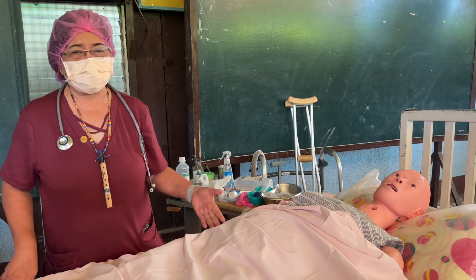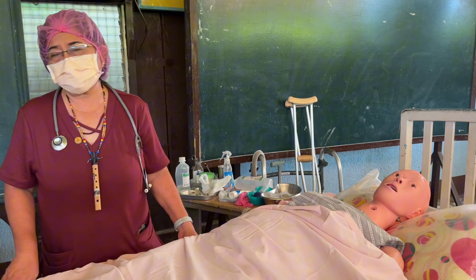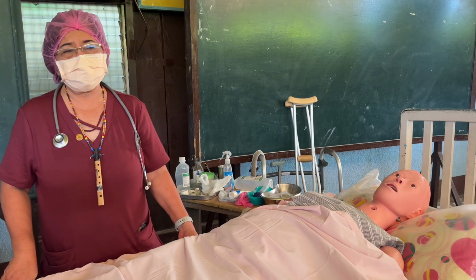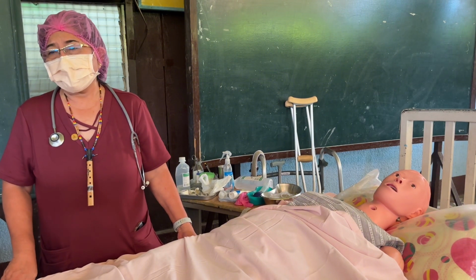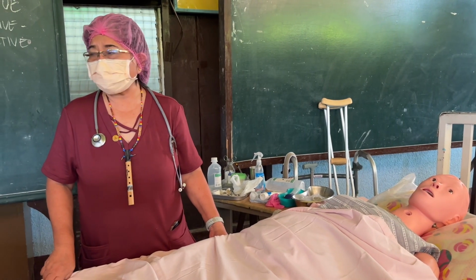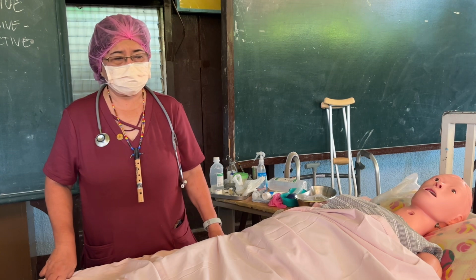and what part of the stomach or abdomen has been hit, whether the stomach or other organs of the patient. And also, I have already mentioned gastric decompression. Before abdominal surgery, the abdomen or the stomach should be cleared of the abdominal contents or gastric contents so that the doctor will have an easy visualization of the organs being affected.